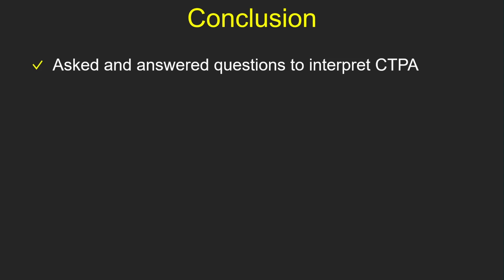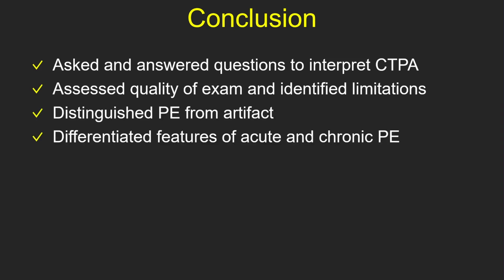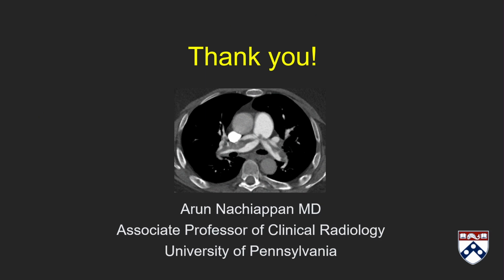In conclusion, we did the following: asked and answered questions to interpret CTPA, assessed quality of exam and identified limitations, distinguished PE from artifact, differentiated features of acute and chronic PE, evaluated for RV strain, and discussed optimization techniques for problematic CTPA.